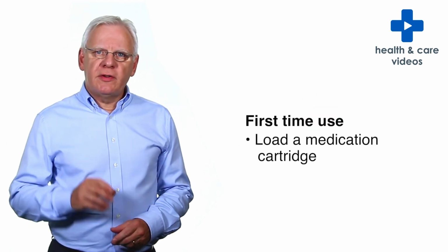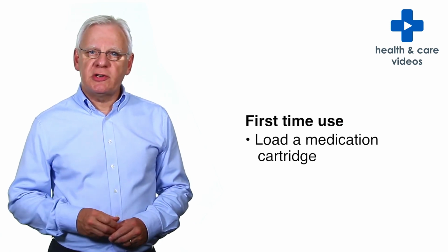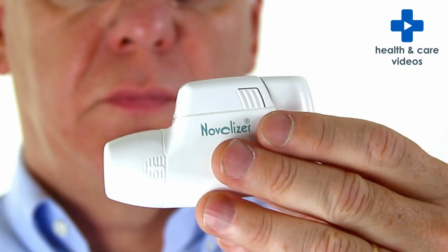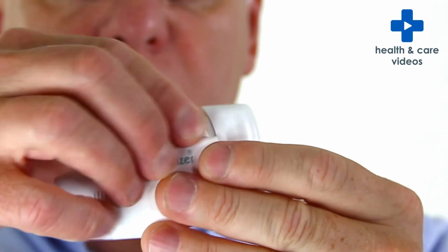Before using your Novolizer Inhaler for the first time, you must load a medication cartridge into the inhaler. Remove the lid of the inhaler by gently squeezing the bumpy ridges on both sides of the lid and pull forwards and up.